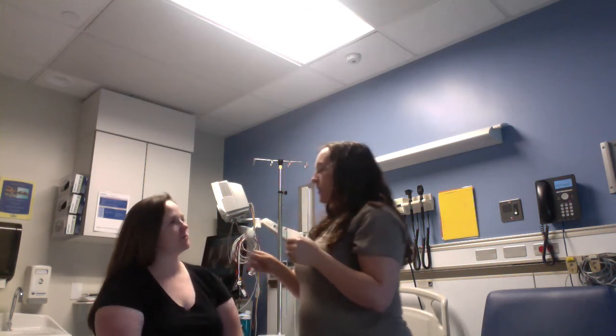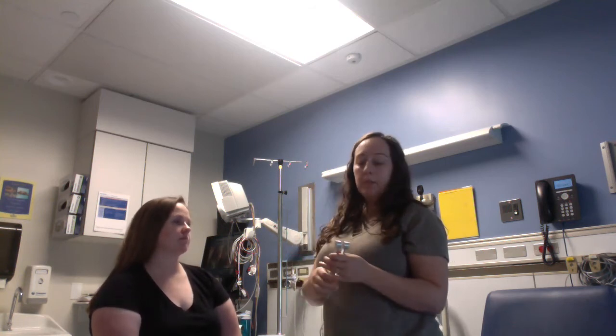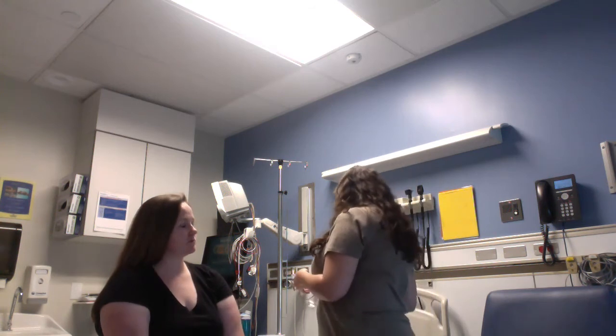Okay, good. So we want them to be able to hear it when we bring it forward, because we want air conduction to be greater than bone conduction. And that's what we're testing for with these two tests: we're testing the conduction of the ears, which your ears have very good conduction.